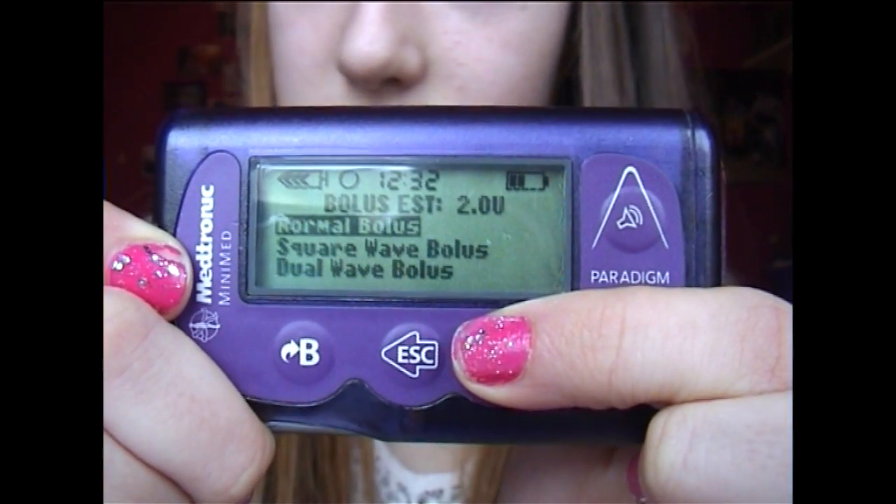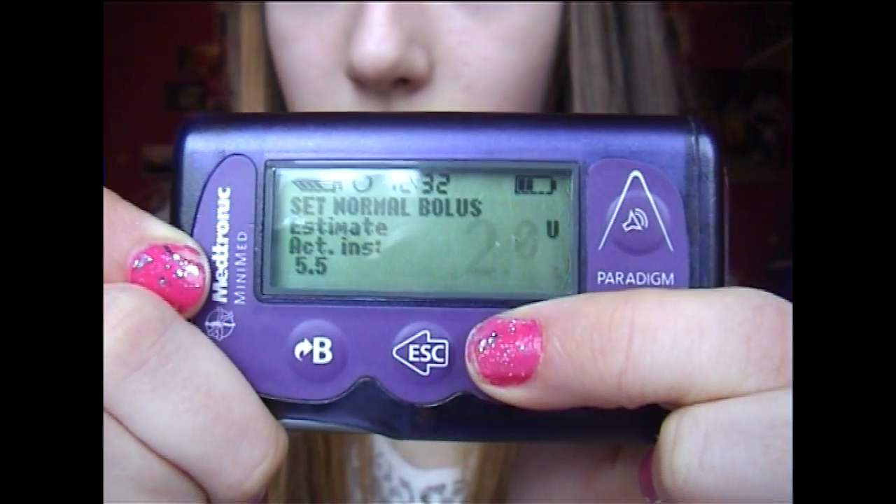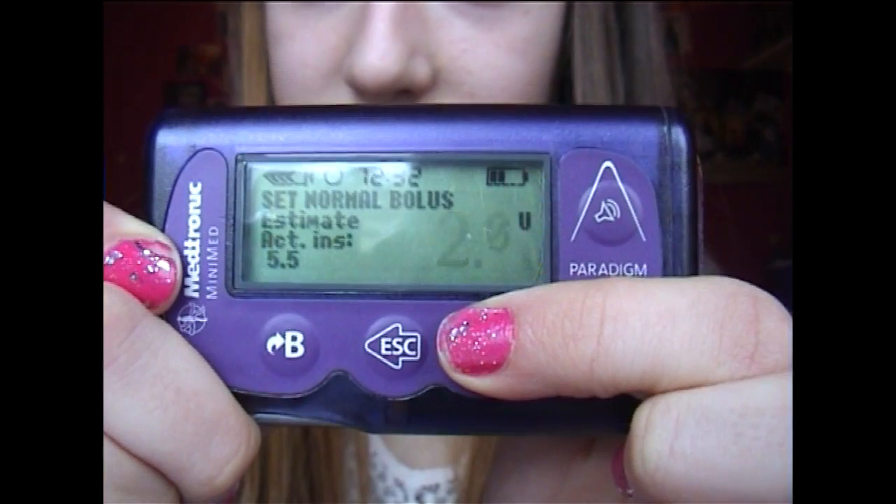I can choose whatever type of bolus I want to do — one that just goes straight into my body, or one that works over a couple of hours — and then I will give myself the insulin.